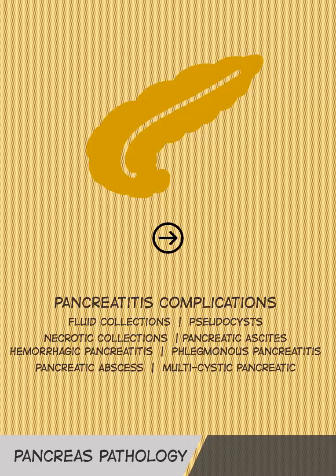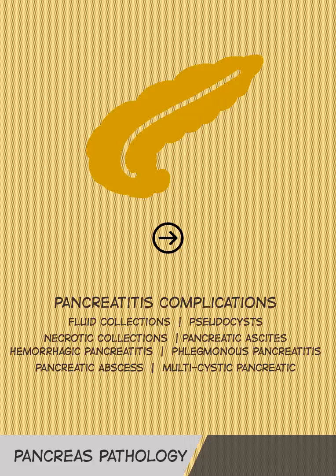In this video, you will learn about common pancreatitis complications and how they appear on ultrasound.